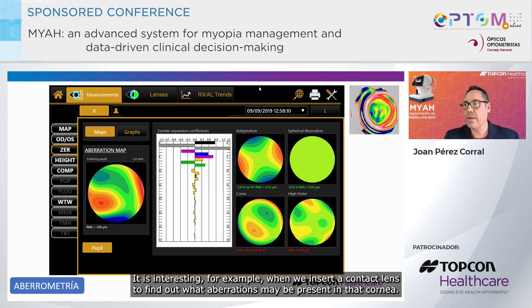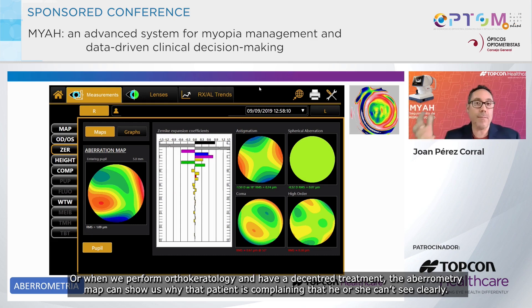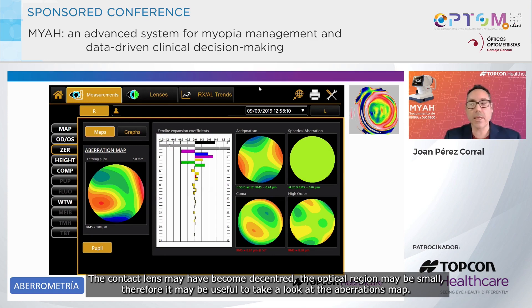It is interesting, for example, when we insert a contact lens to find out what aberrations may be present in that cornea, or when we perform orthokeratology and have a decentred treatment — the aberrometry map can show us why that patient is complaining that he or she can't see clearly. The contact lens may have become decentred, the optical region may be small, therefore it may be useful to take a look at the aberrations map.